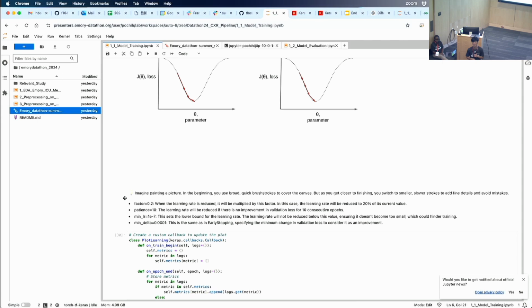I was thinking that maybe you start with that one and then initiate the early stop function. I'm also not sure how that plays out, because in the chronology of the coding, we have the early stop function followed by the reducing learning rate function, and I was wondering what happens if we stop. Yeah, that's a good suggestion.